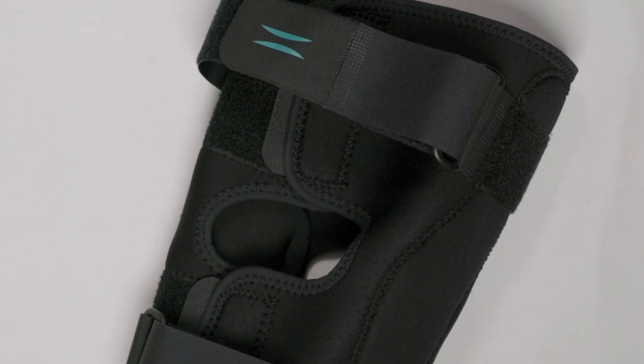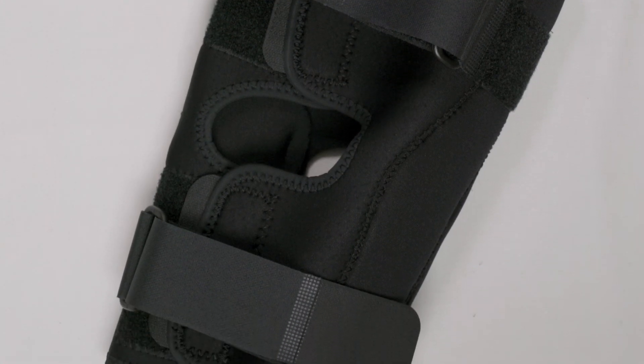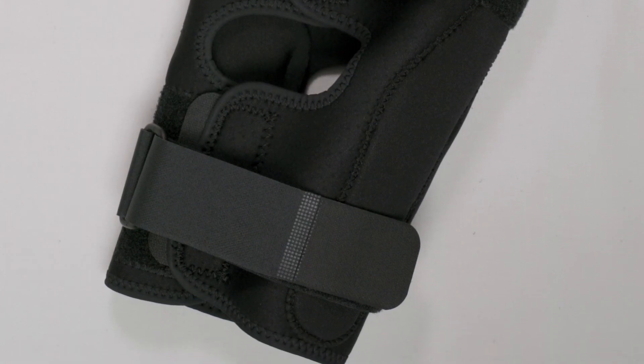Not one of those things may make you too excited, but add 10 of them built into one brace and it gives you all the reasons you need to use the best on your patients and not compromise. Doctor, which one of those benefits is most important to you and your patients?